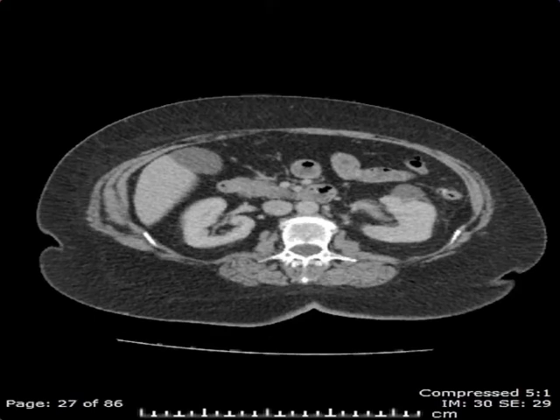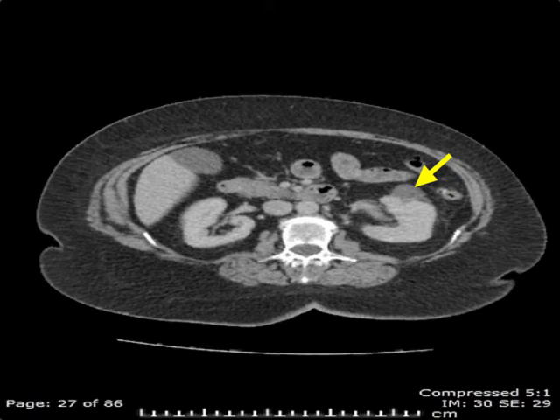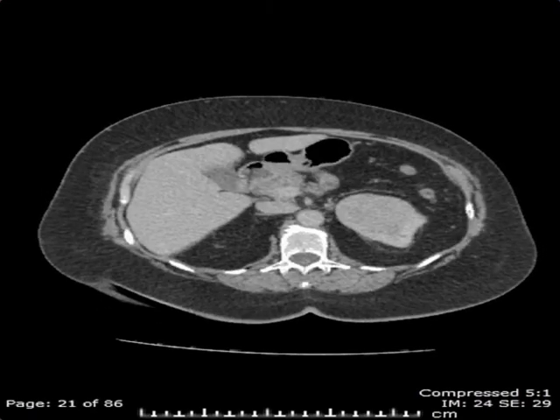There is an additional mass in the left kidney seen more inferiorly. However, if we observe and measure its density value by placing a Hounsfield unit measurement over this, we'll see that it measures simple fluid — somewhere between minus 20 and 20 Hounsfield units — thus indicating that it reflects a simple cyst.